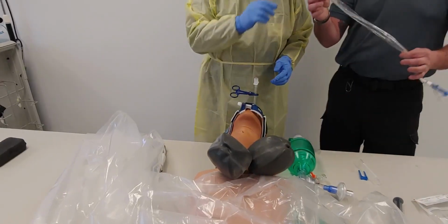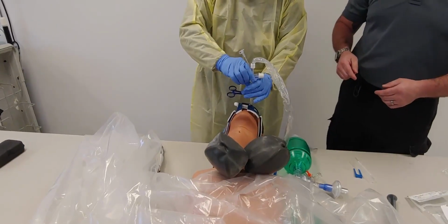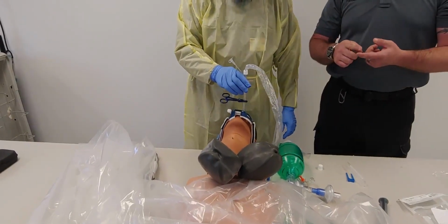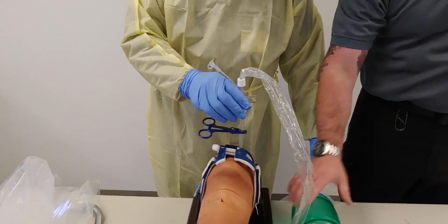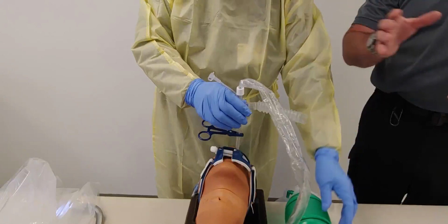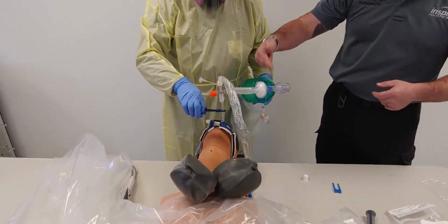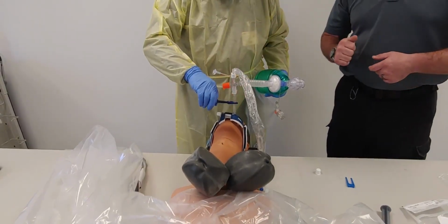Now this is our inline suction. Goes on completely. This white port is where your ventilatory circuit is going to come from. So whether that's a BVM or in hospital, that's your actual vent circuit, or for SCT, that's our Revel circuit. This is where it attaches. We have this corrugated tubing, which helps release some of the pressure on the tube itself so it doesn't move around, helping to make sure we don't dislodge it. So now we have our ventilatory circuit, our end-tidal CO2, our viral filter, little piece of corrugated tubing, and now our actual tube itself.